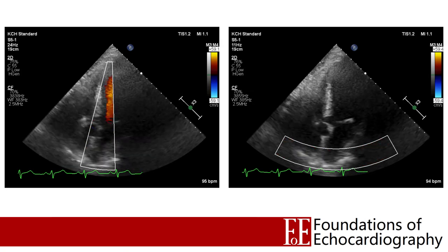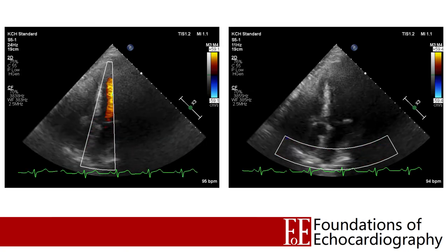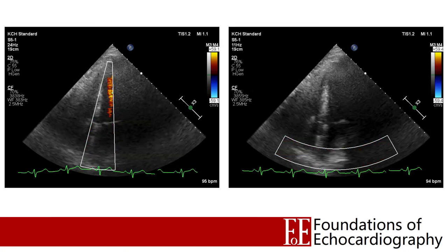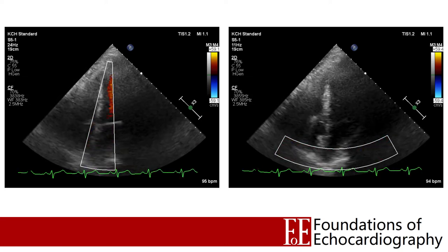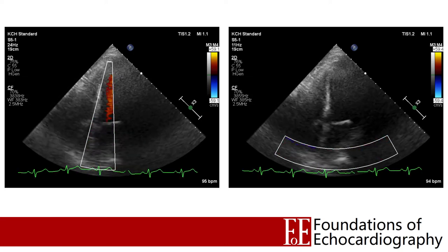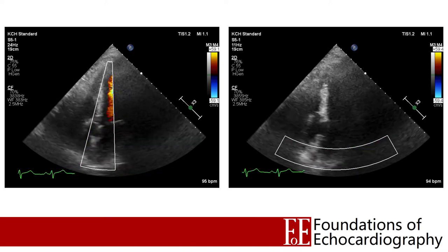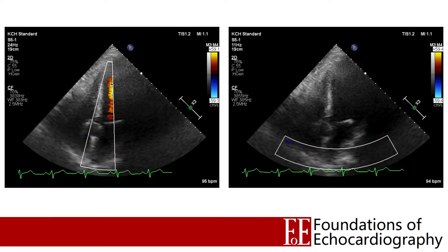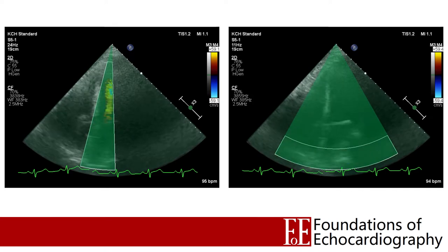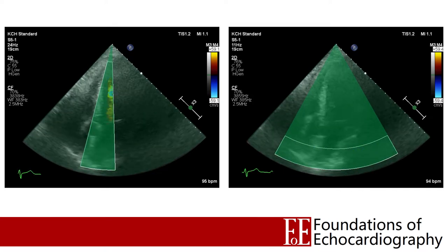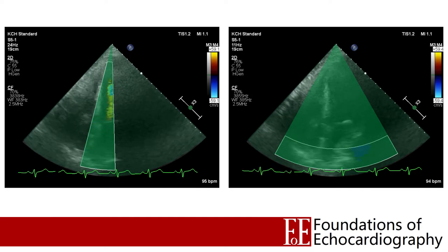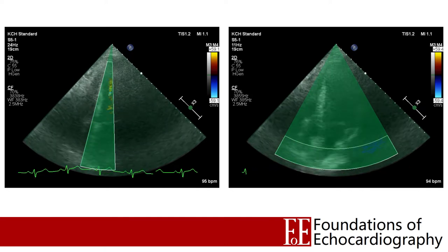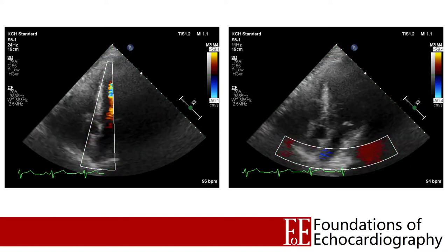Let's take a look at an exaggerated example. Here we've got two apical 5 chamber views, both with a sector width of about 90 degrees and a depth of 19 centimetres, and both clips have a colour box on occupying a roughly similar area on the image. But the clip on the left, which has a very narrow colour box, has a frame rate of 24 frames per second, whereas the clip on the right, with a very broad wide colour box, has a frame rate of just 11.